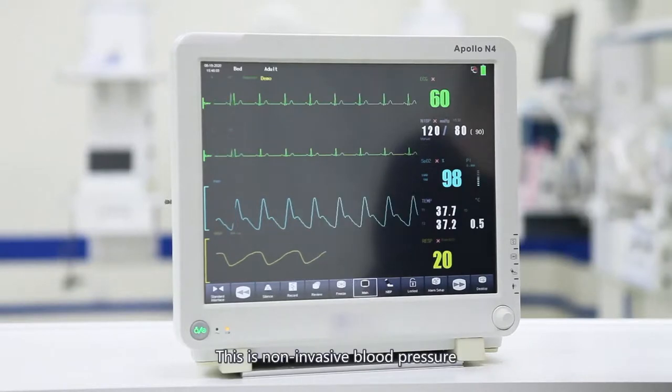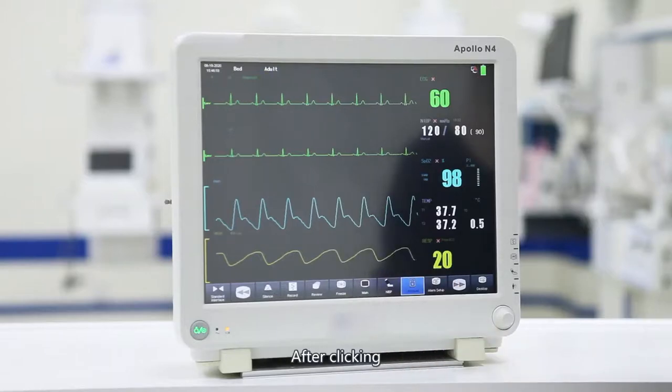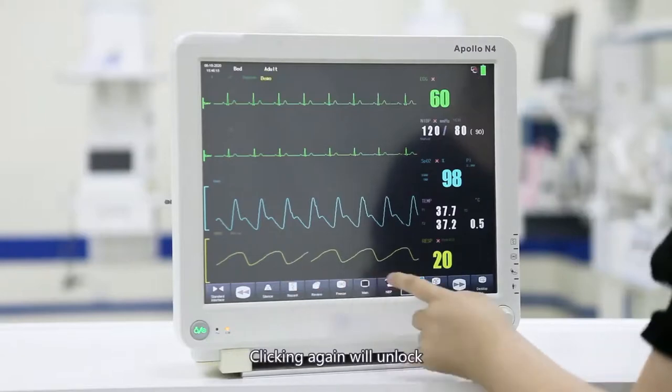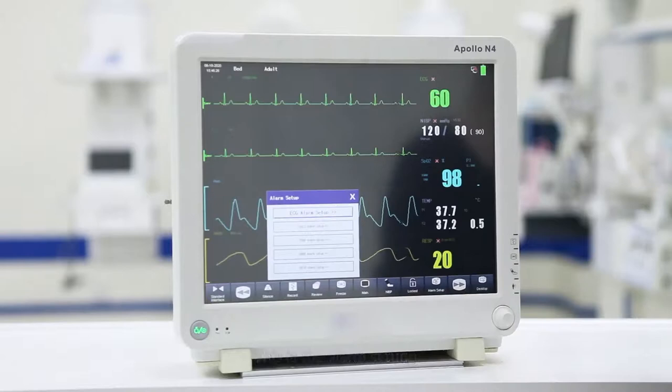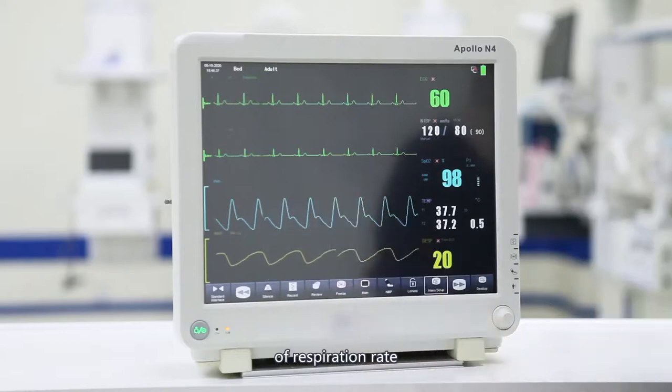This is the non-invasive blood pressure; click to measure blood pressure. This is the lock screen. After clicking, the shortcut interface is locked and cannot be clicked; clicking again will unlock. This is the alarm setting, which can set parameters such as ECG, blood oxygen, temperature, and non-invasive blood pressure upper and lower limits of respiration rate.